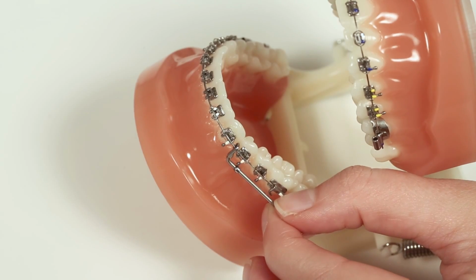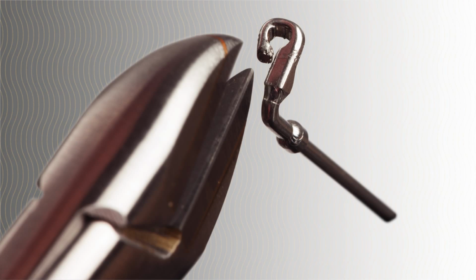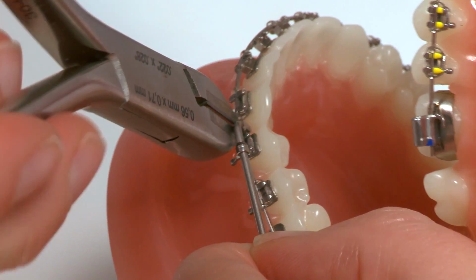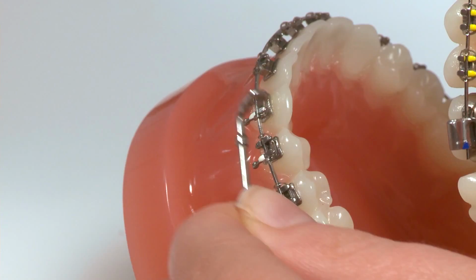To remove pushrod, turn mesial hook so crimped ends are facing labially. Using a hard wire cutter or ligature cutter, place the cutter blades where the crimped ends of the mesial hook meet. Squeeze the cutters so the blades wedge the mesial hook open. You can now remove the pushrod from the arch wire.